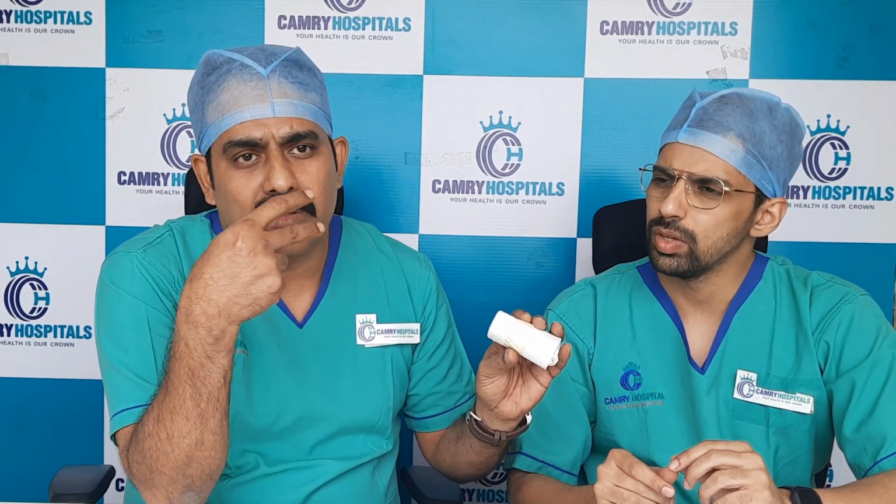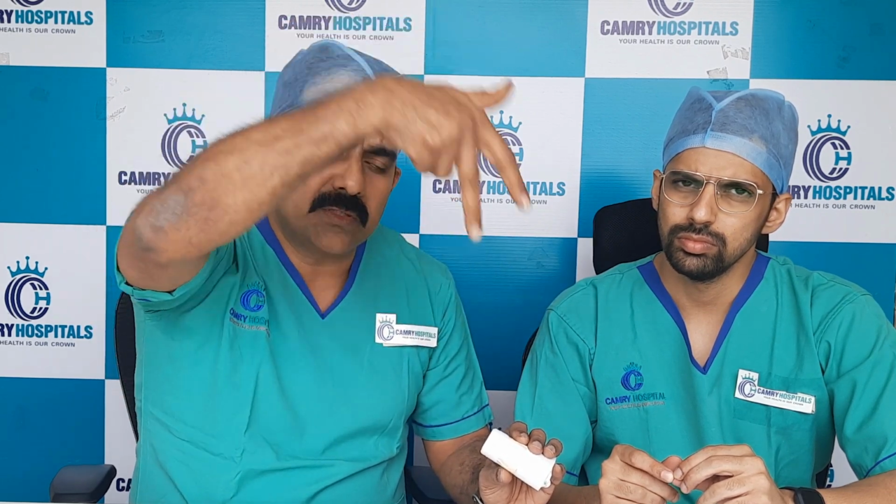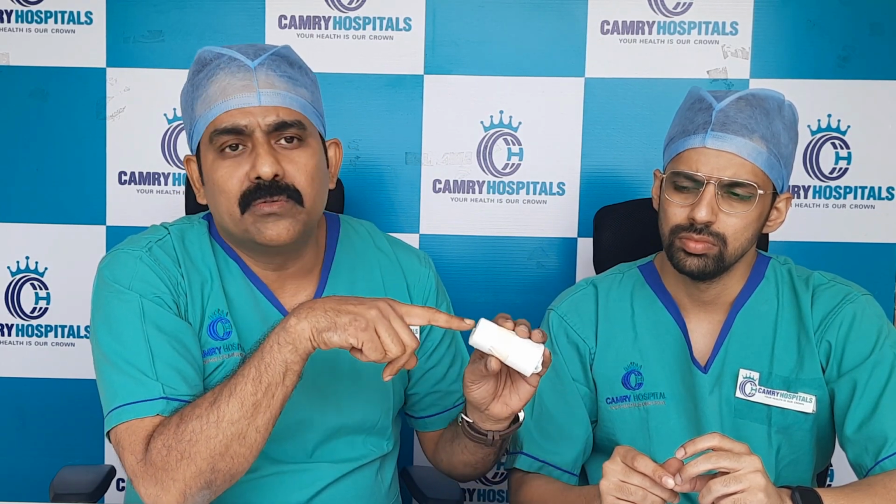So even in this we can do fixations, screw fixations, it's called stabilization. Earlier we had to open up and put screws through the open procedure. Now under computer imaging we can put endo screws also, done through a very small incision, and that too under local anesthesia. The fancy of this surgery is that the patient is awake, and recovery time is just 24 hours. No ICU care, no need of any urinary drainage. The patient can pass urine within an hour, go to the loo, and have food within 1 hour. As simple as that.